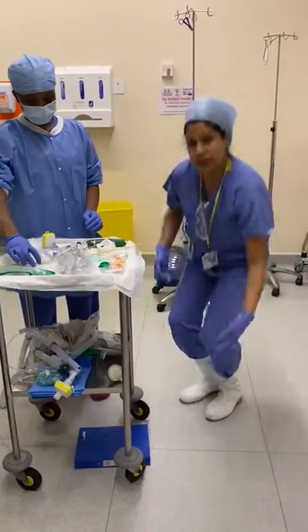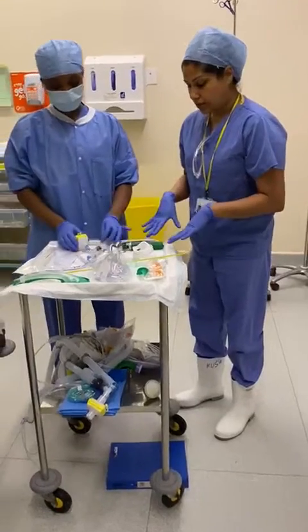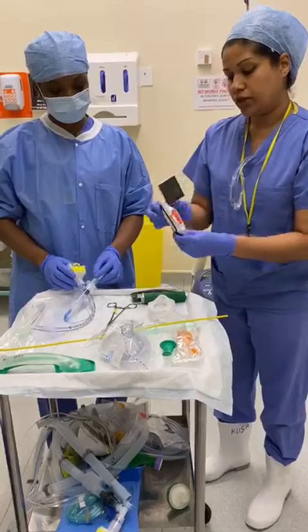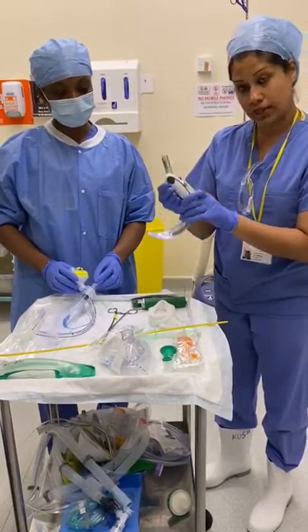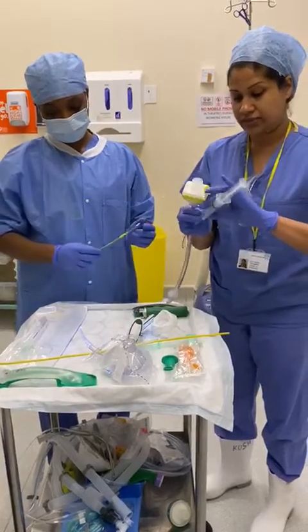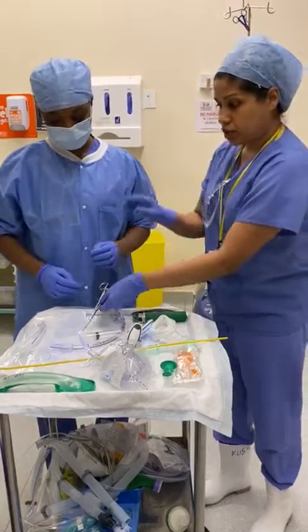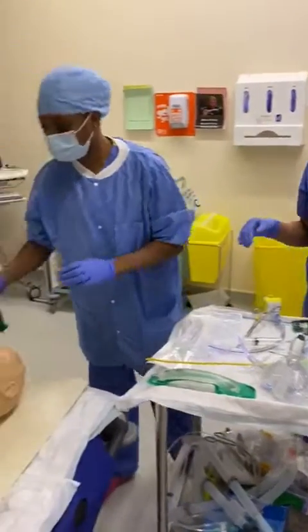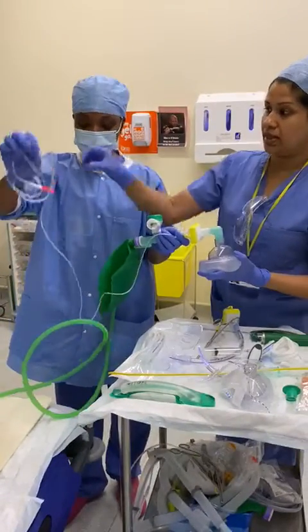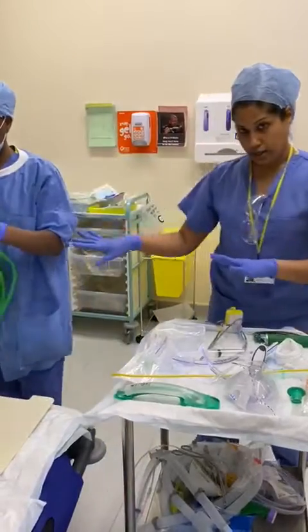Now, imagine I'm completely donned in my PPE. The first thing you're going to do is get your airway equipment ready. Tina's going to help me with that. You've got your bougie, you've got your McGrath blade and handle. Make sure that it's working. You've got your tube loaded with the viral filter, syringe loaded onto the cuff, and you've got your clamp. Make sure that you've got the C-circuit and your mask as well. This should be attached to the oxygen supply and capnography attached to the monitor. So that's your airway kit ready.